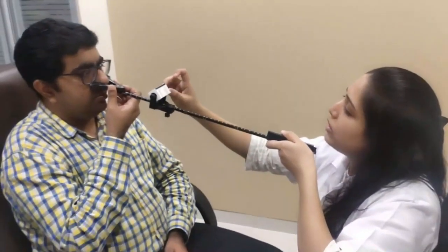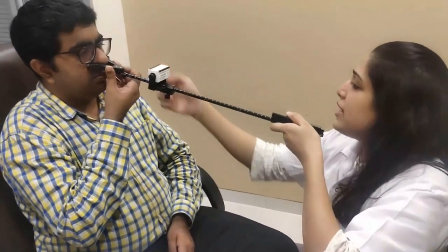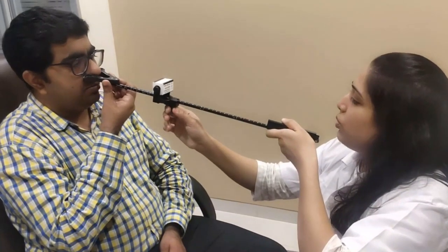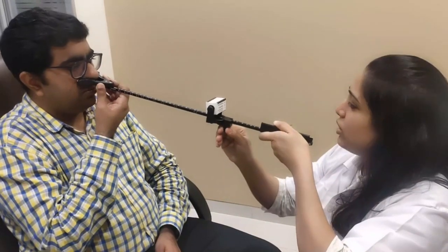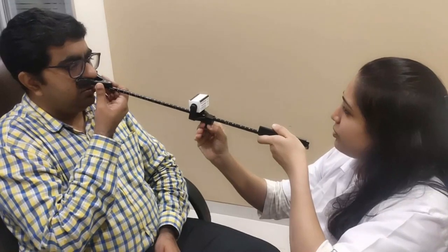Let's look at the patient's near point of accommodation. Can you see these letters here? Yes. The third line in the letters? Yeah, it's clear. Okay. When I get it close, it will be clear and then it will appear blurred. Okay? Yeah. When it appears blurred, please let me know. Sure.